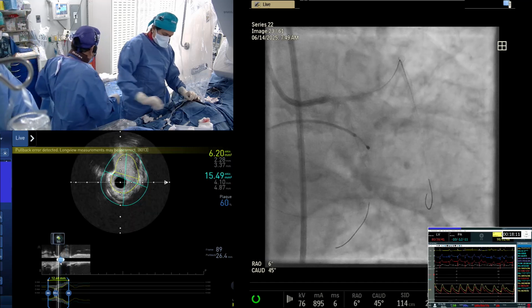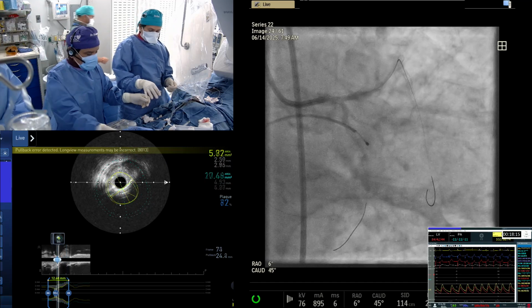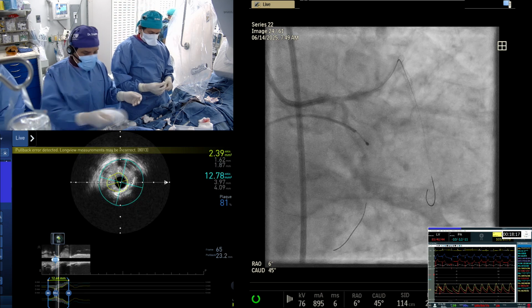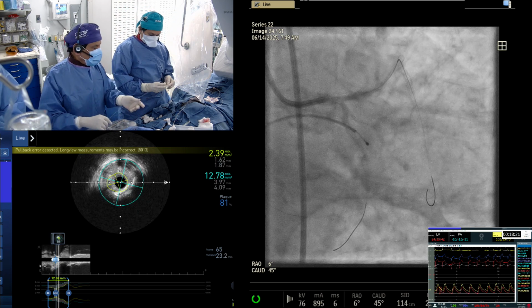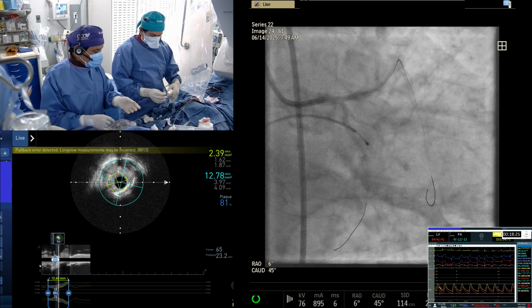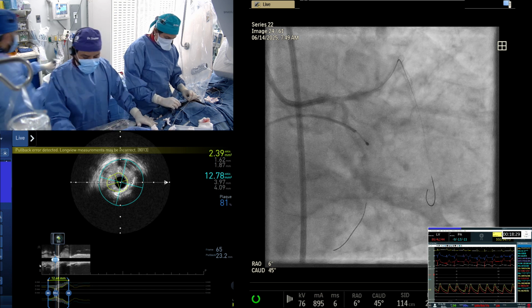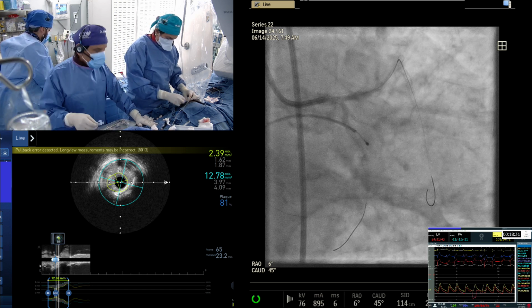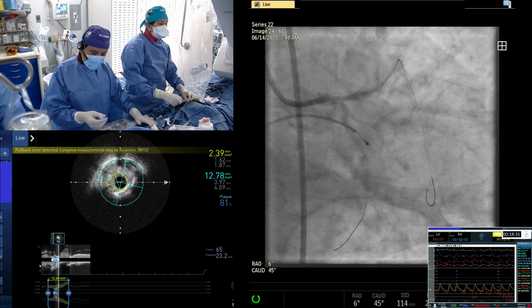And we are not going to use the European approach, that if the side branch looks good in the EBC, they dilate every case with the kissing. Here, if it looks good, the circ looks good, we leave it. Because our Excel data did show that in a single stent approach, routine dilatation was not helpful, rather it has a trend towards higher stent thrombosis at 4 years.